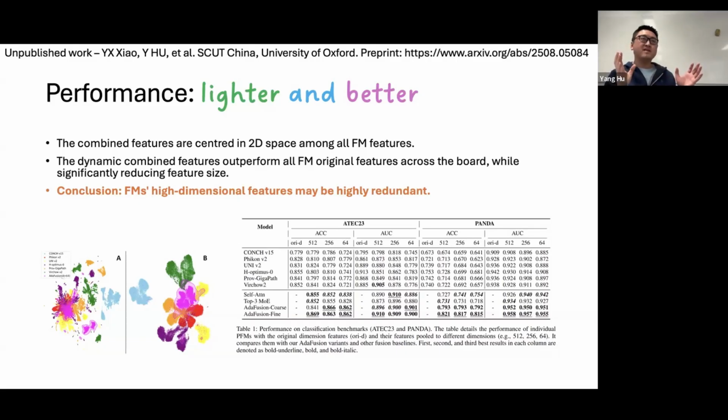What we are doing is using a graph neural network to distill the foundation models, so that the graph neural network inherits some knowledge of the foundation model, but it is also explainable about how the different cells are associated and communicating with each other. So we can provide another format of interpretability result beyond the attention, right? That work will be submitted very soon.